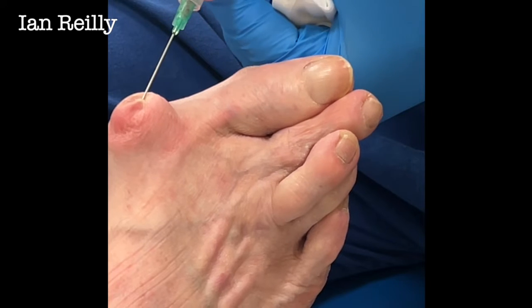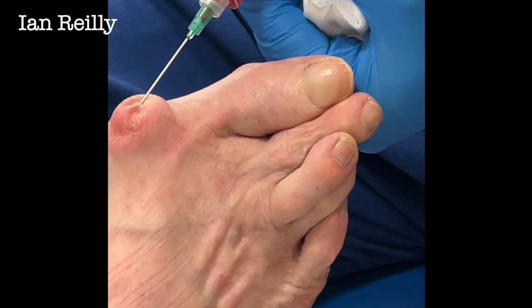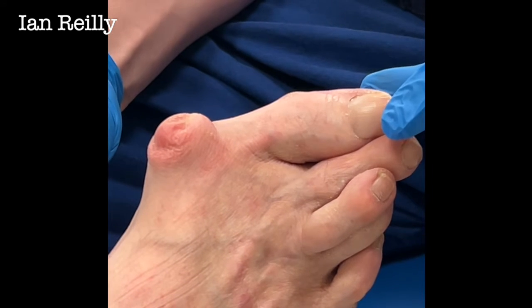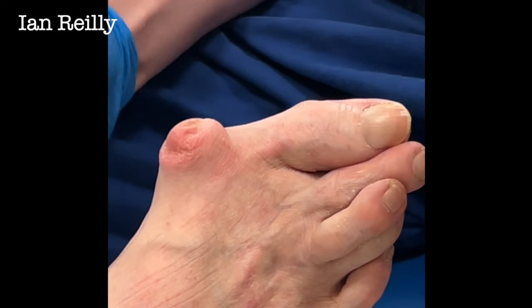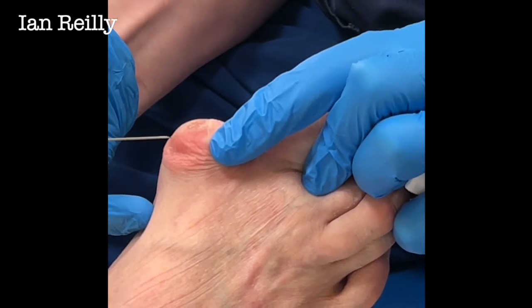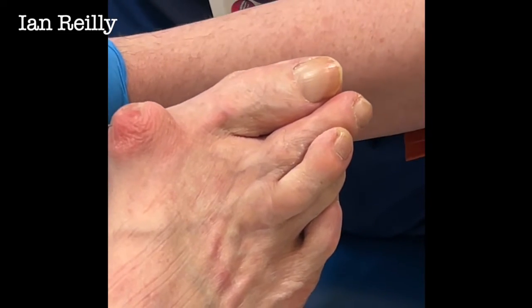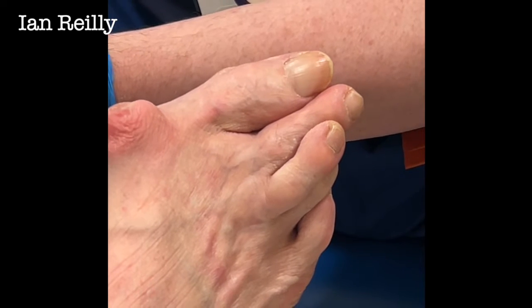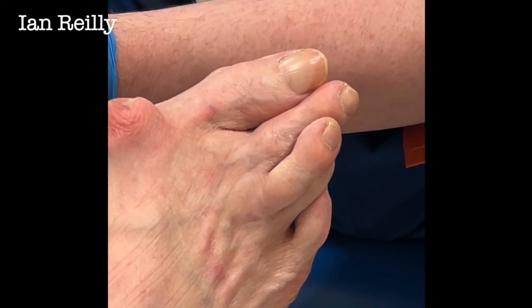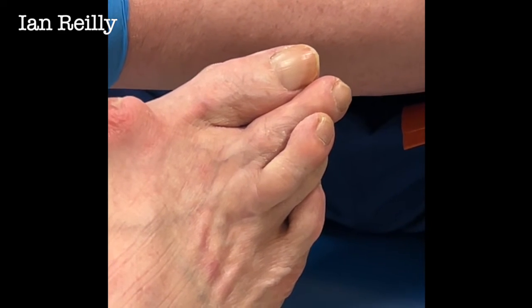Let's try and put a bit more suction on that. It's going to come out, Alan — you're going to hear a little pop. I'm just going to come in from another angle. Scratch again — three, two, one, scratch. Sorry, my fat hands are in the way, viewers. But that's the best bit, Alan. Okay, so that's really quite juicy now.